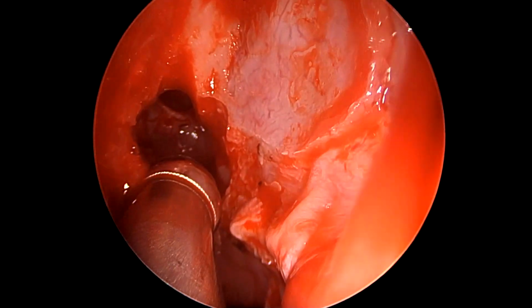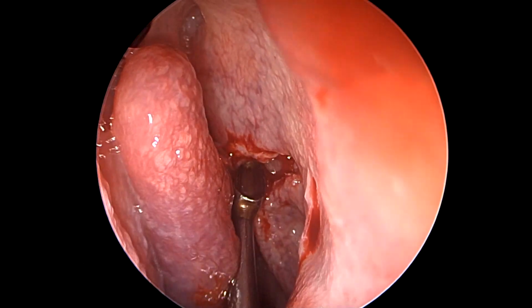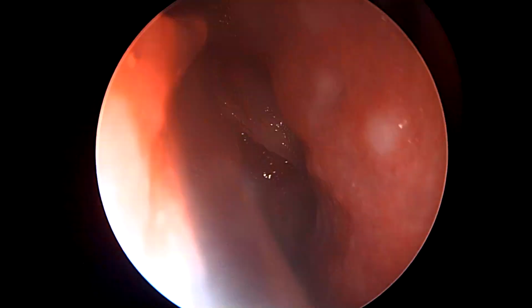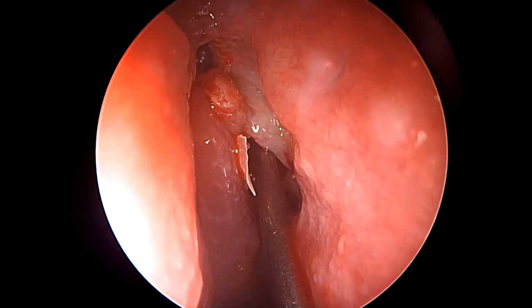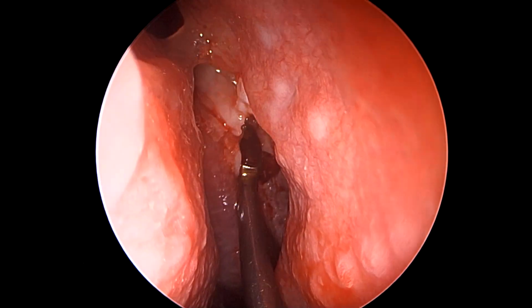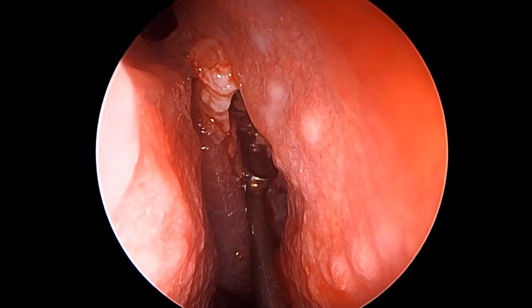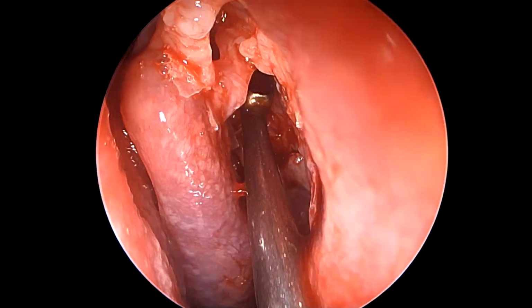And in absence of any gross polypoidal mucosa, the opening seems to be reasonably good. The exposed bone of the frontal beak, however, would be healing with some amount of granulation in the post-operative period. You could probably use a lot of heavy douching with saline and steroid to try to reduce the granulation that causes stenosis in the frontal sinus.